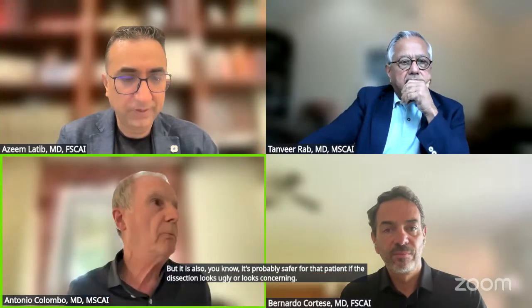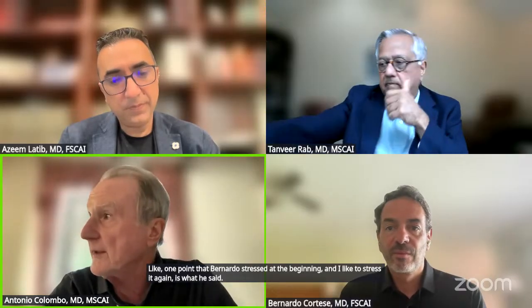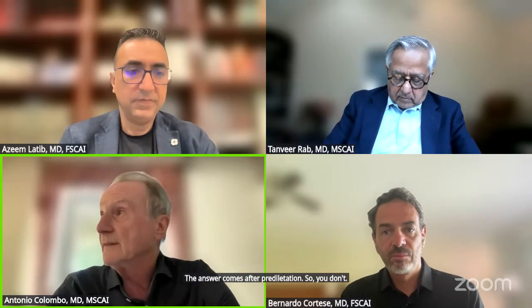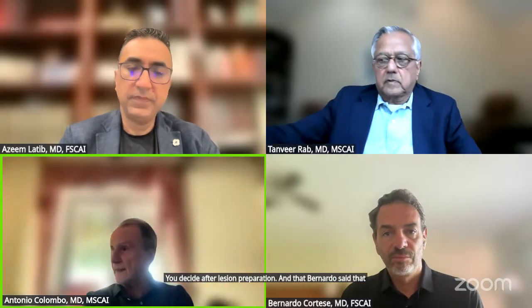But one point that Bernardo stressed at the beginning, and I like to stress it again, is this. Should I use a DCB in this lesion? And the answer he gave to this question is, I don't know. The answer comes after predilatation. So you don't decide at the beginning. You decide after lesion preparation. Bernardo said that, and I like to reiterate.